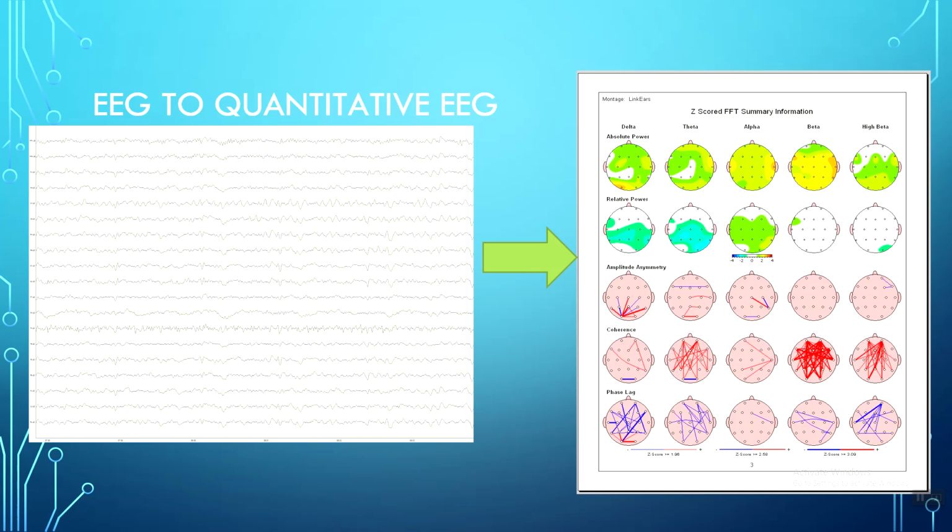And so the EEG on the left is what I call the seminal text. That is the Sanskrit, right, or the first writing. Pali. The quantitative EEG, what's that? The Pali. Yeah, the quantitative EEG is a translation.